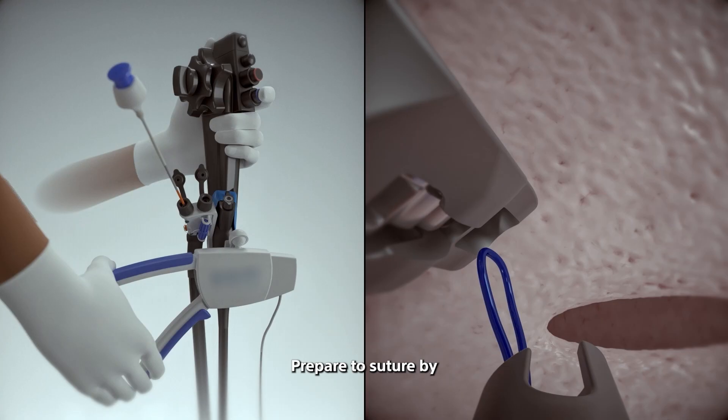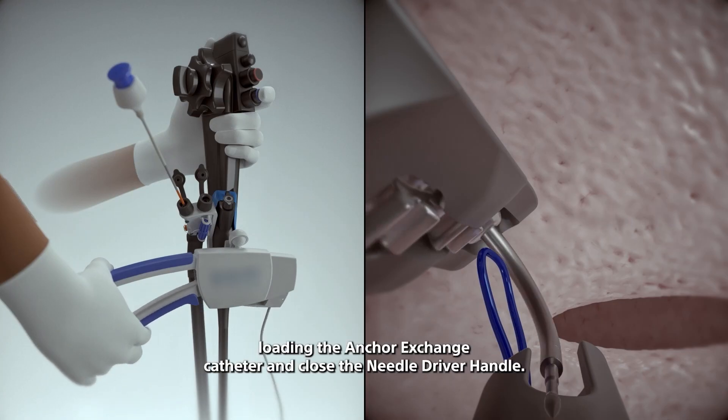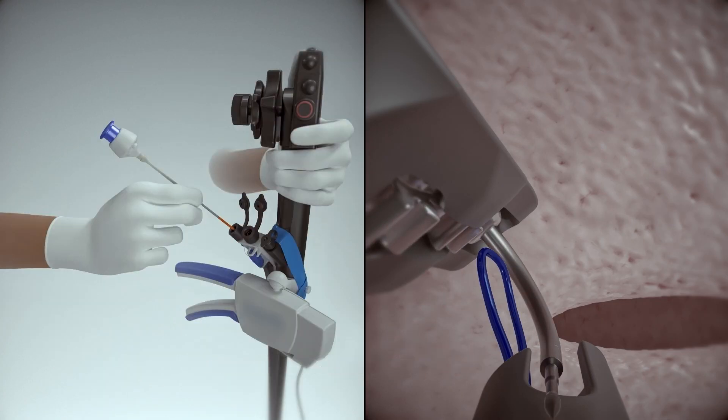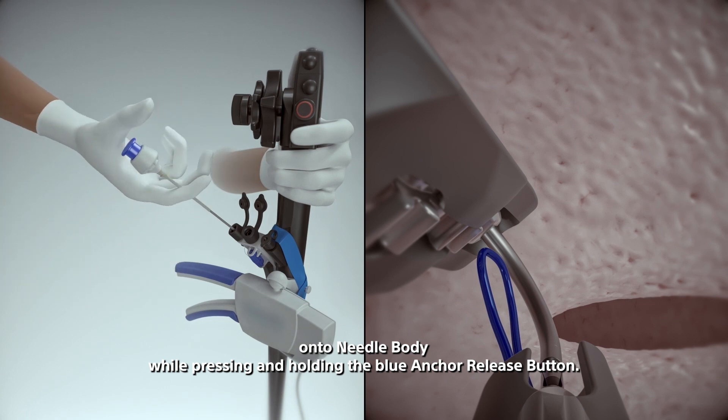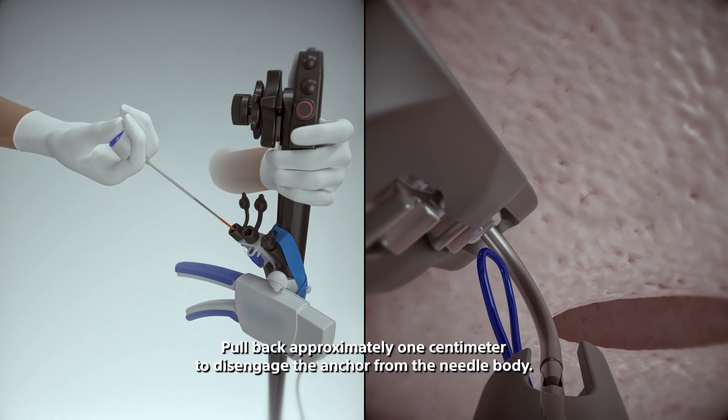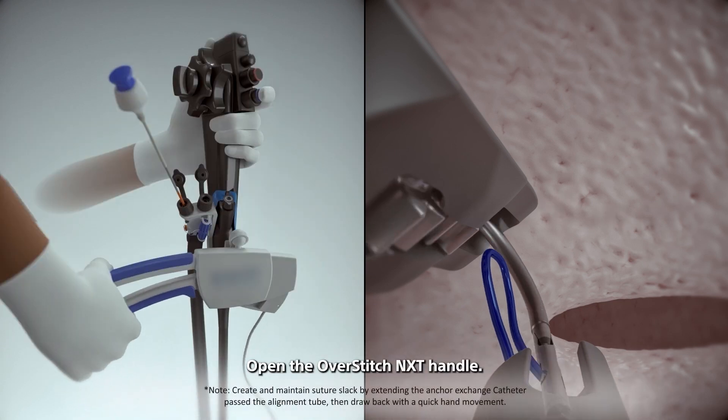Prepare to suture by loading the anchor exchange catheter and close the needle driver handle. Using a pencil grip on the white portion of the cable, advance the anchor exchange until anchor fully seats onto needle body. While pressing and holding the blue anchor release button, pull back approximately one centimeter to disengage the anchor from the needle body. Open the overstitch NXT handle.